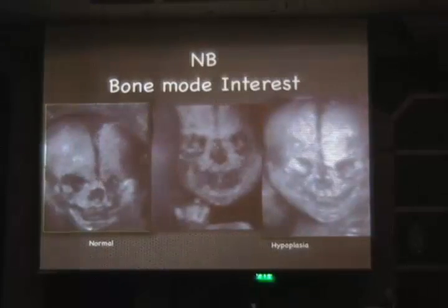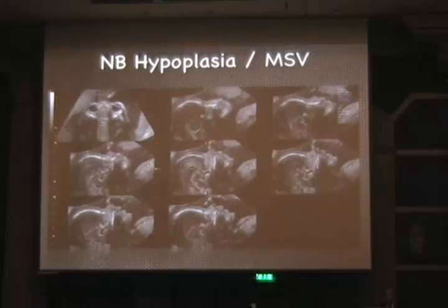See, this is normal. This is abnormal. And you can see the multi-slice view like this. You can be exactly on the sagittal view, not on a parasagittal view on the left or on the right. Here, for example, you see that the corpus callosum is here, and you are sure there is no nasal bone on the same plane.